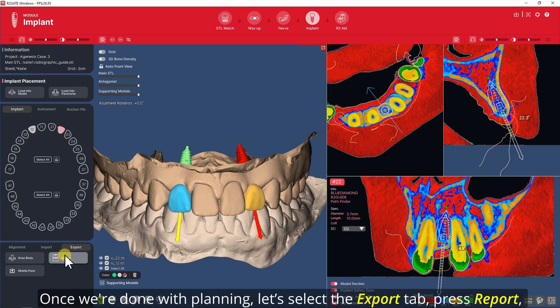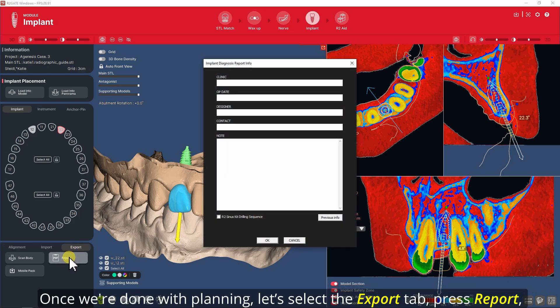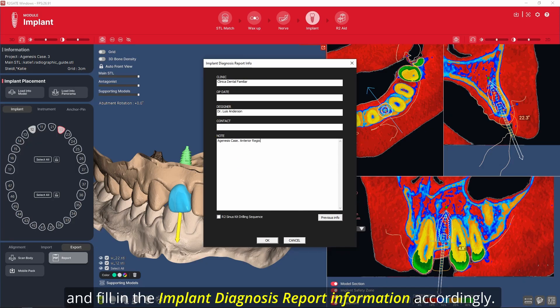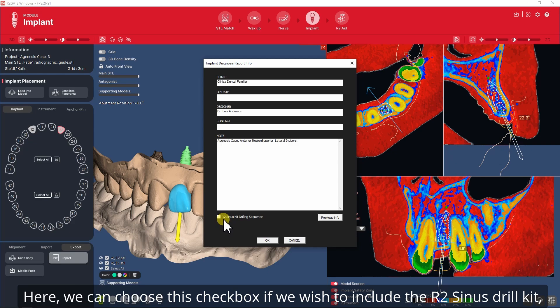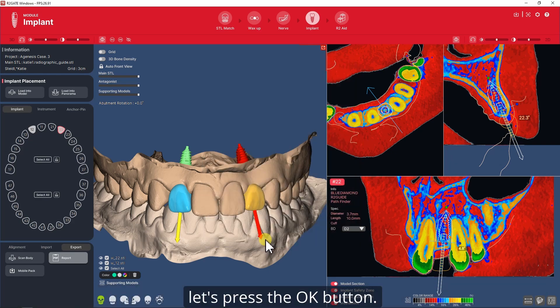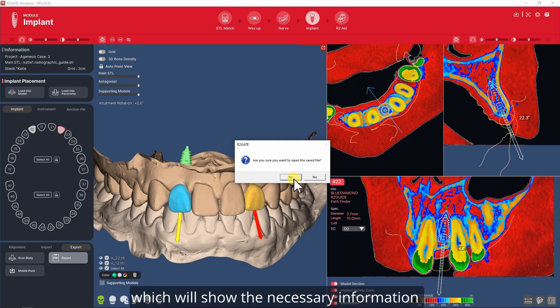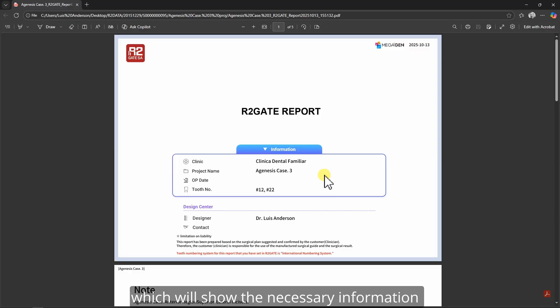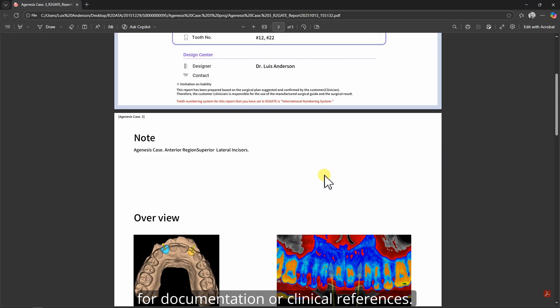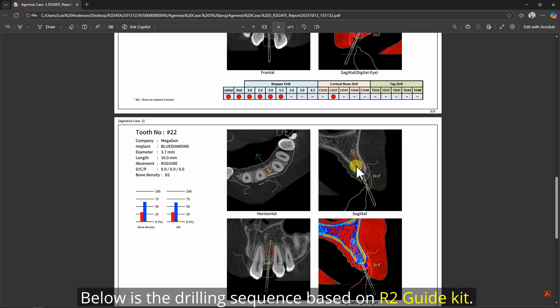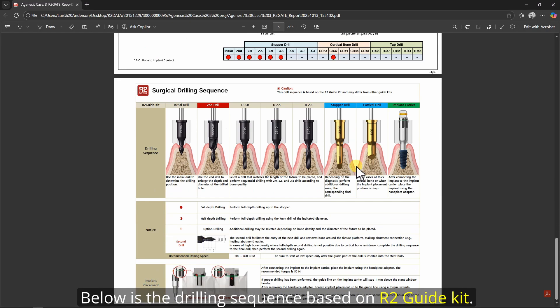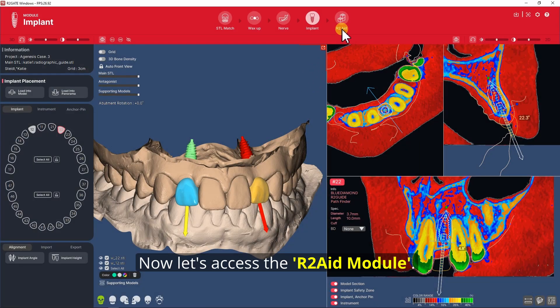Once we're done with planning let's select the Export tab, press Report, and fill the implant diagnosis report information accordingly. Here we can choose this checkbox if we wish to include the R2 sinus drill kit. Let's press the OK button. We'll receive our R2 gate report document which will show the necessary information for documentation or clinical references. Below is the drilling sequence based on the R2 guide kit. Now let's access the R2Gate module.